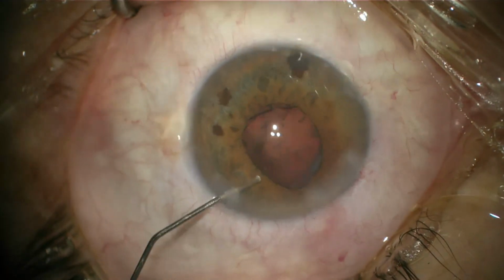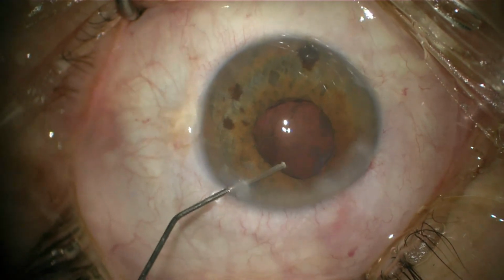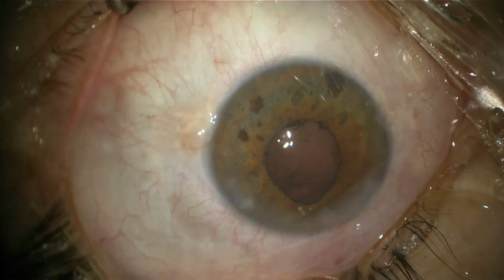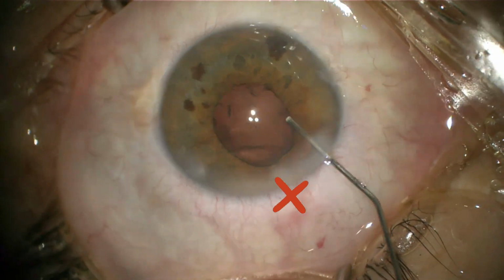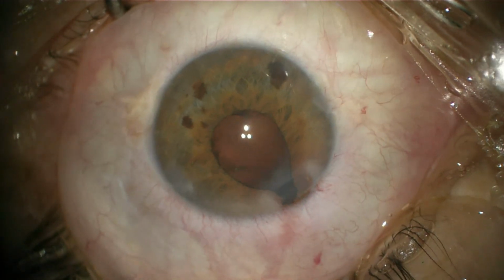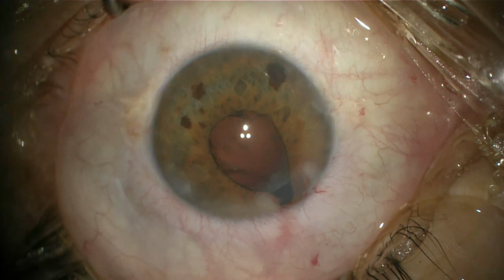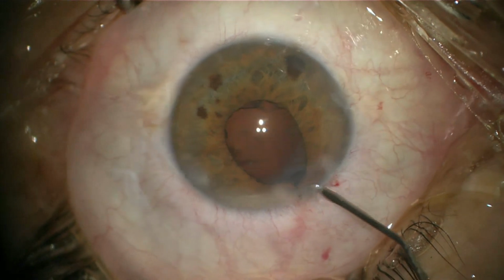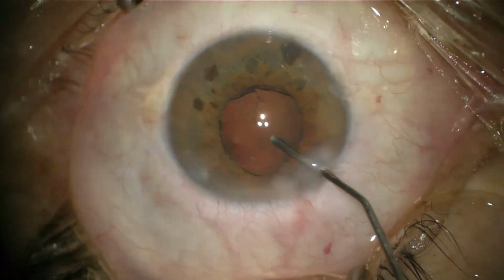Now, here is a good tip. You can flush with BSS the periphery of the lens, which will loosen the cortex, but be careful not to do too much, and please do not go through the main incision because you will end up with continuous iris prolapse. Remember, here you need to play with fluidics. Less pressure in the eye will always help to control the iris prolapse.